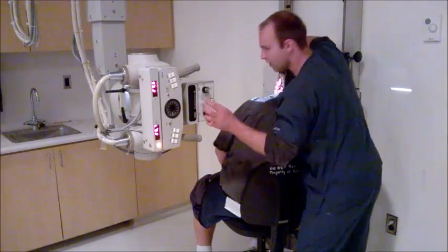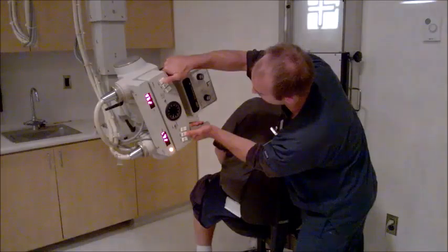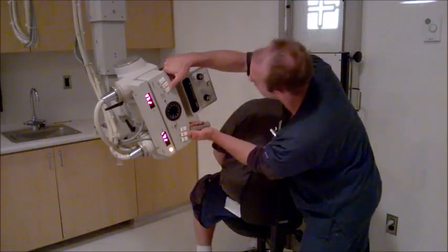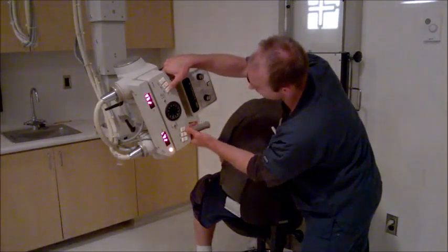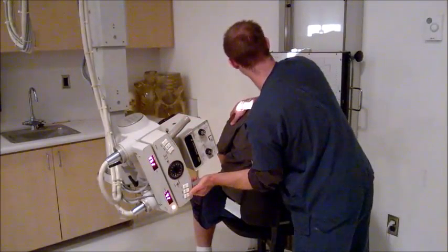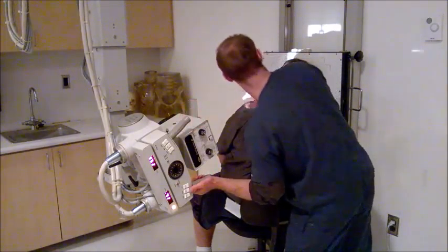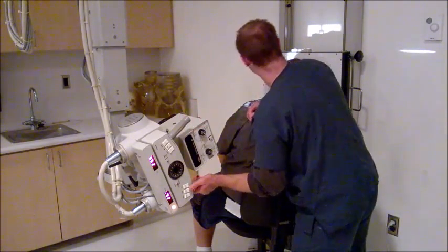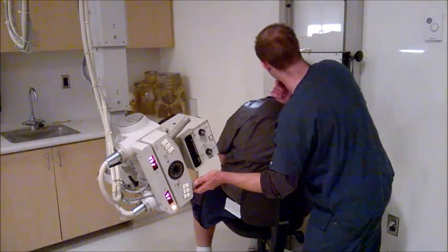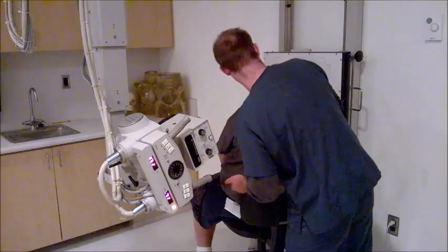And now the CR should have a 25-degree cephalic angle to it, and it should be entering between the mandibular bodies right there. Depress the shoulder because that sometimes gets in the way. So it's going up and right between the two bodies. There we go.